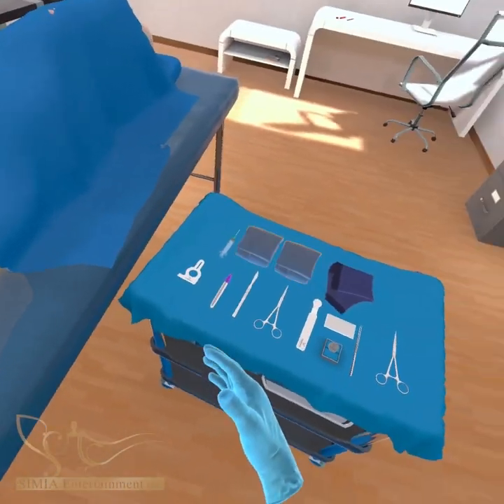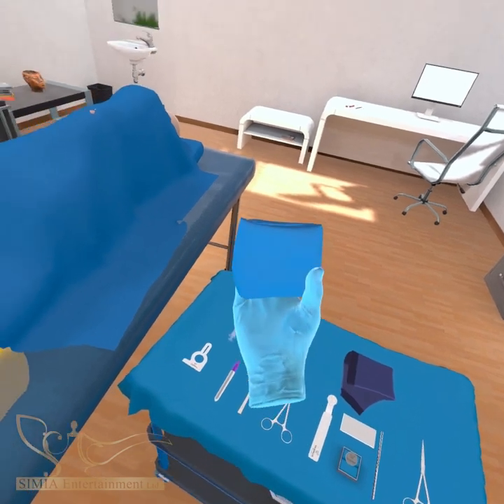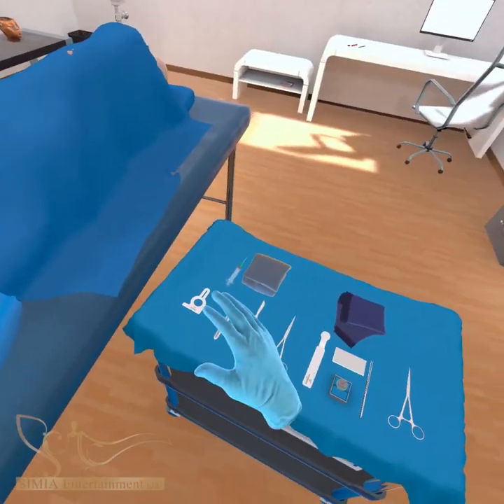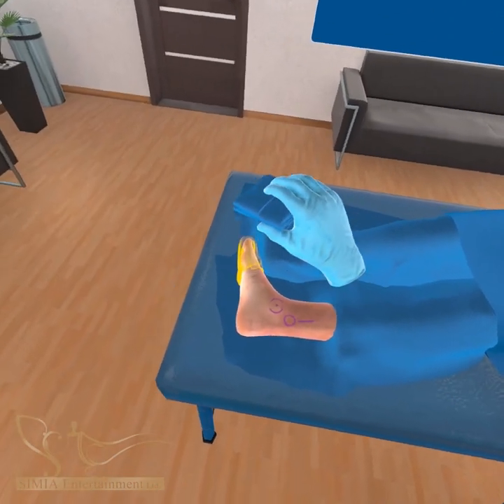Carefully drape out the foot and leg with towels and a fenestrated drape. The toes may be covered with a sterile glove since no interrogation of the device is required.